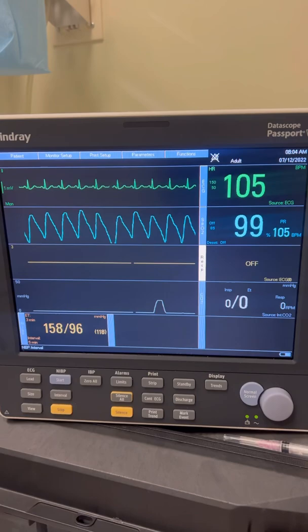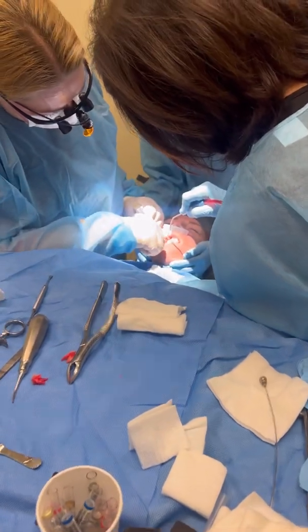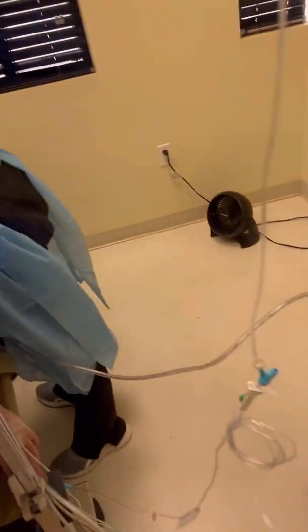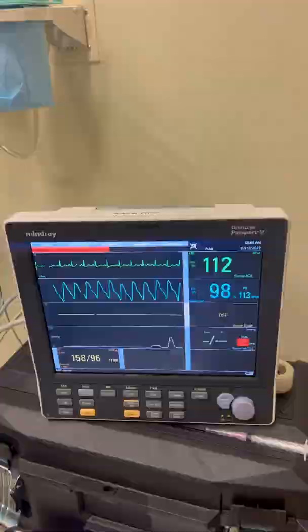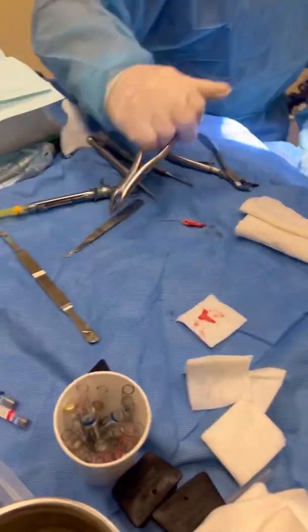I'm giving that a few minutes to settle down because she did get some epinephrine absorption. There's my propofol pump running, and my CO2 has kind of gone away for a second because we're manipulating the head. She has moments of apnea, which she can tolerate. While we extract, we have to push down and sometimes they obstruct, but there she goes — she's starting to breathe. Heart rate is still 112. I give it maybe five to seven minutes before I do something about it.